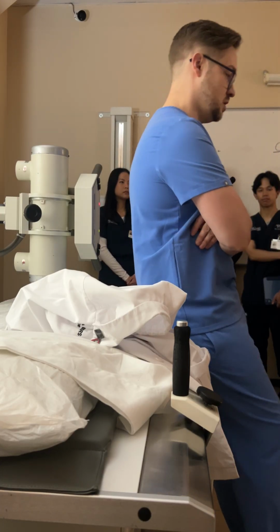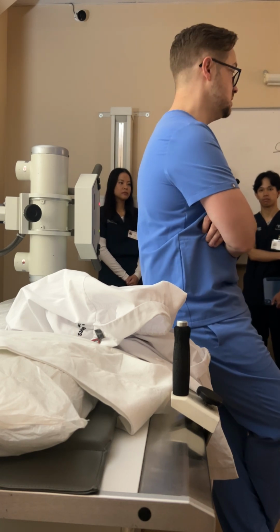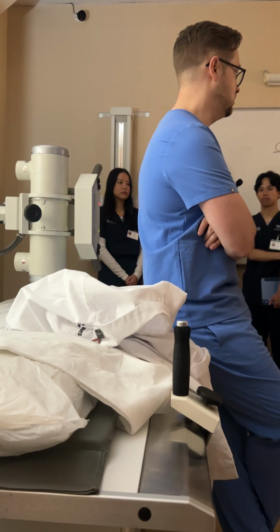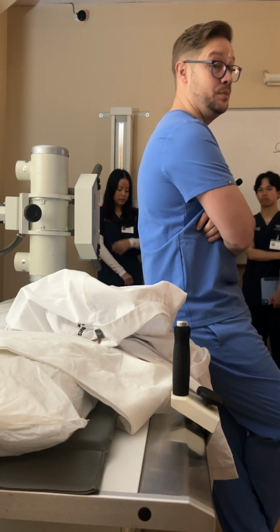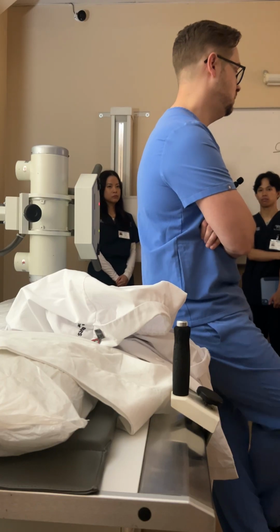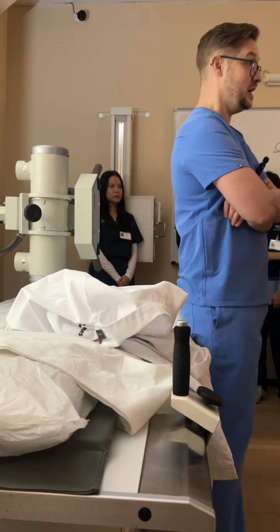If they come in through a trauma, we typically have to wear PPE and make sure that we don't get it on us, but we're not responsible for that kind of cleaning of a patient. Now, if they're bleeding all over your x-ray table, yeah, you have to clean that up. We don't let them bleed and then call environmental services, because then environmental services would hate us.